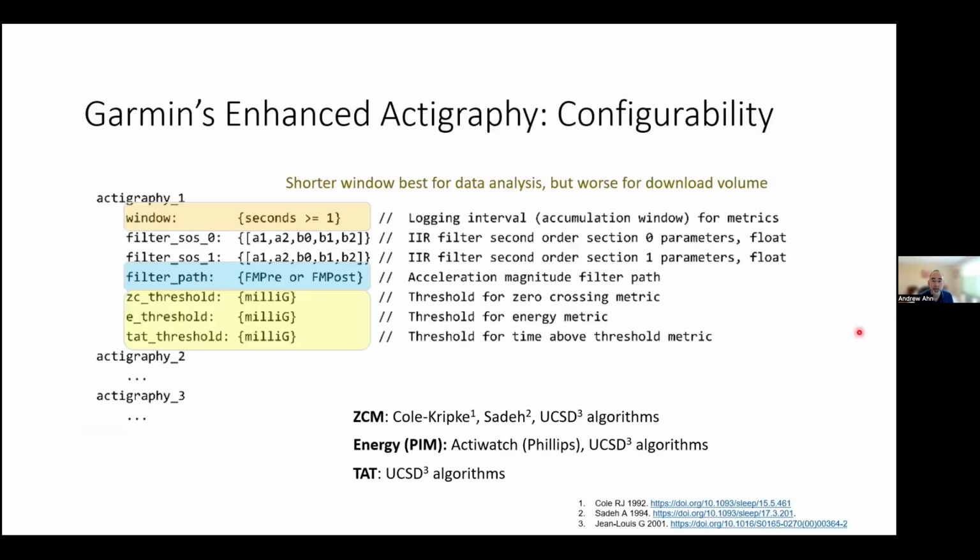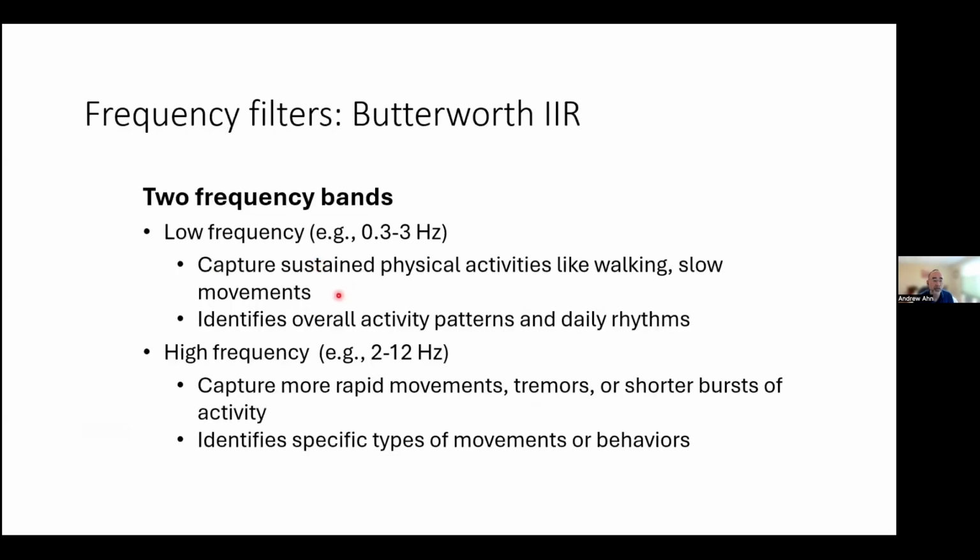Now, finally, the filter configuration. The Butterworth filter enables us to choose the frequency range, and it gets a little complicated here. Again, this is something where you'll have to reach out to us to establish what settings or parameters you would need to put as coefficients into this equation to choose the frequency bands that you're trying to go for.